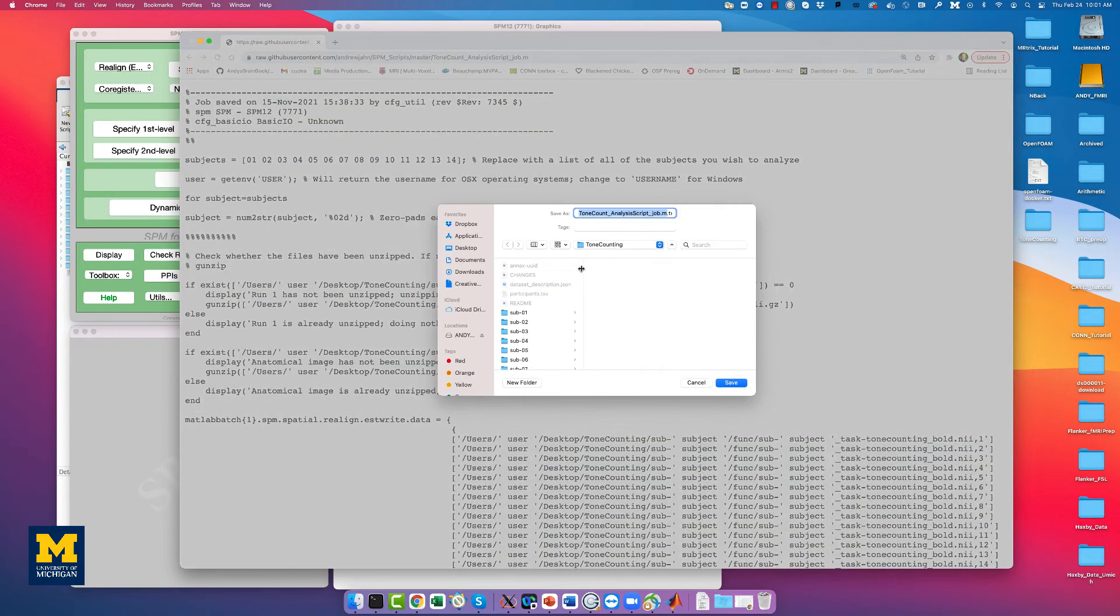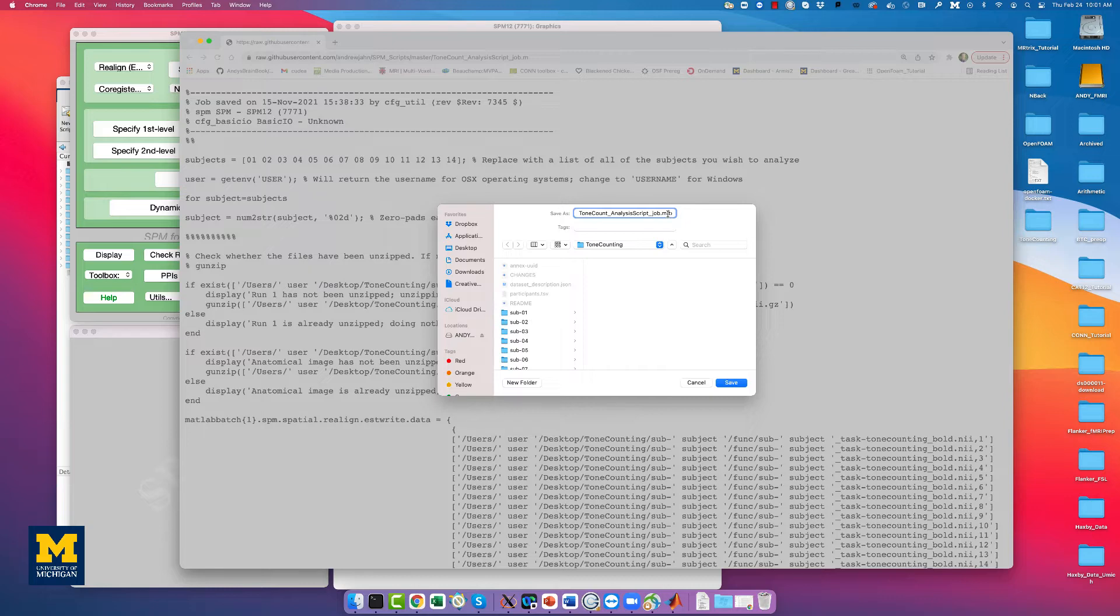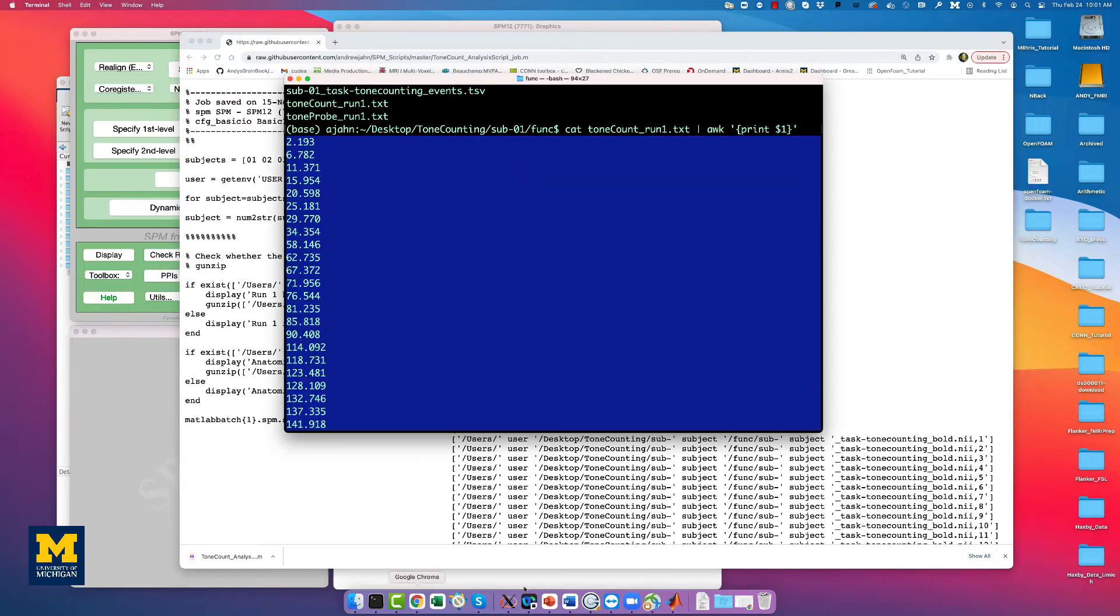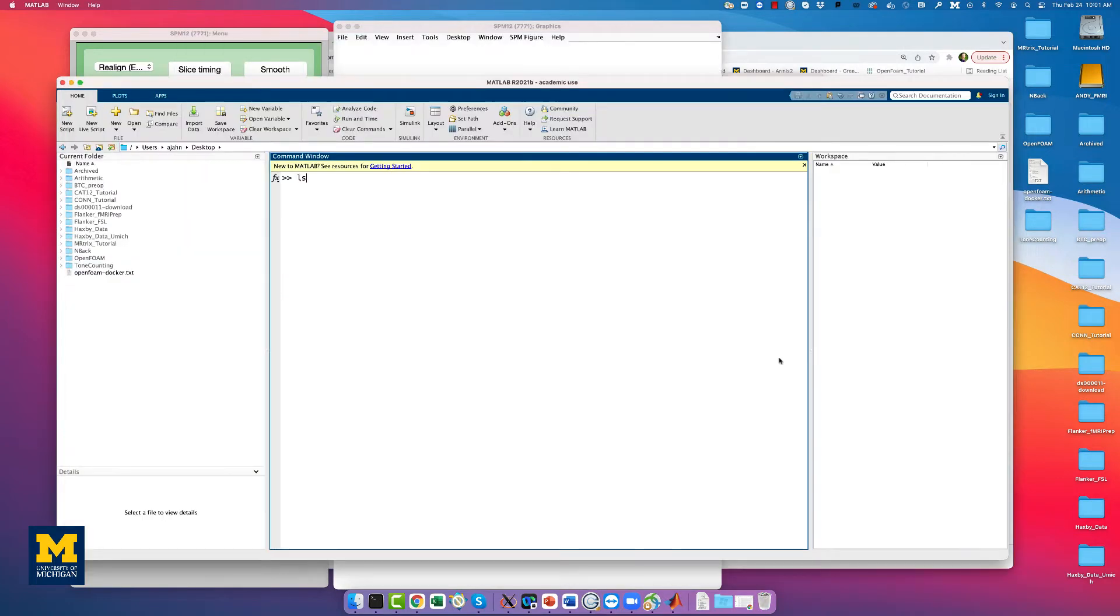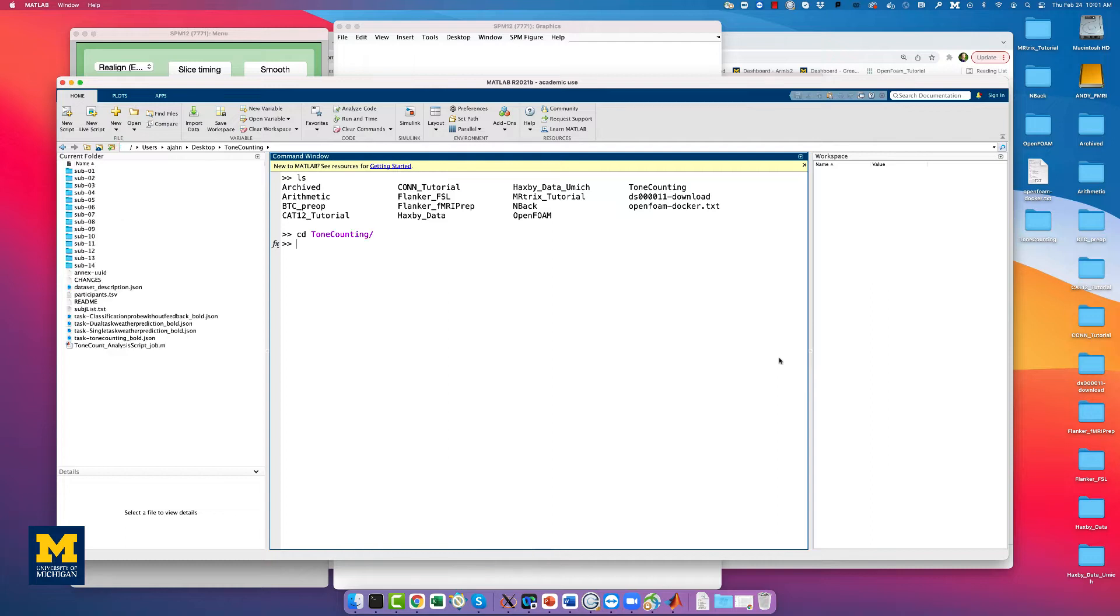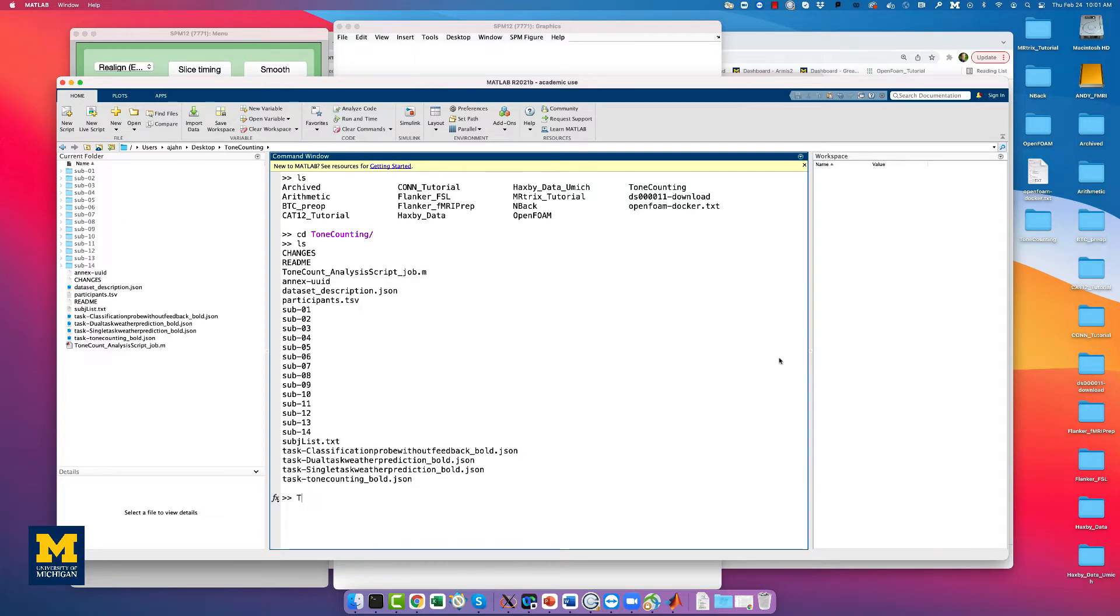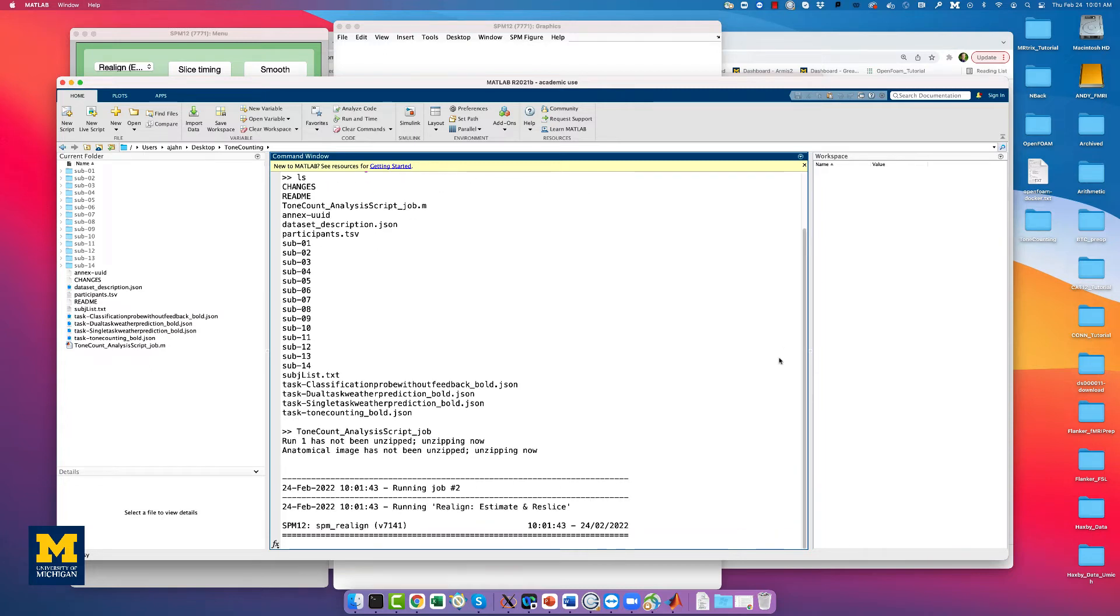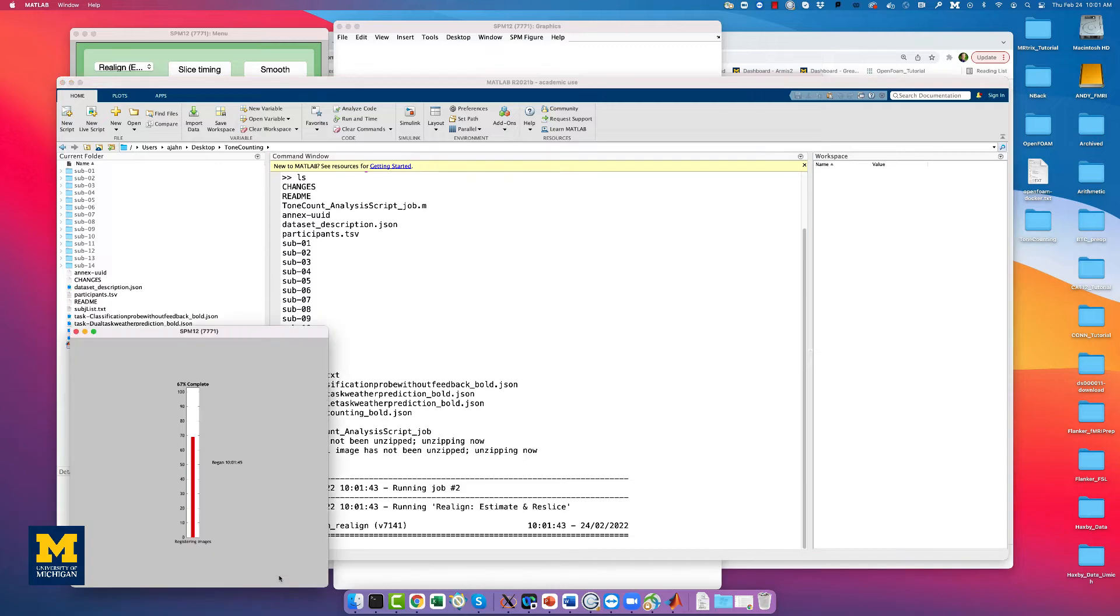Right-click anywhere, click Save As, and then save it to your tone counting directory, removing the .txt extension. Then you can go back to your MATLAB terminal, and navigate to the Tone Counting directory. Run the script by typing Tone Count Analysis Script Job and pressing Enter. This will take about an hour to run for all the subjects.